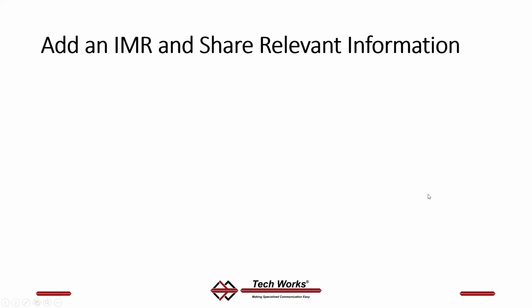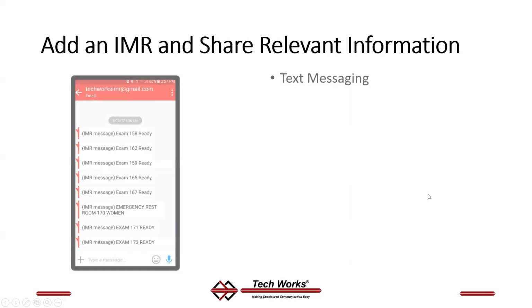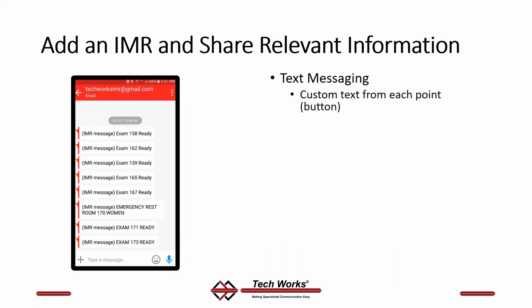Let's talk briefly about adding an IMR and sharing relevant information. Why would you want to add an IMR? Well, because an IMR takes the button pushes and lights of our clinic call and our nurse call and puts them out as text messages. Any point on a system can have an associated text message built into the IMR, programmed into the IMR, that will go out and go to any phone, any carrier.